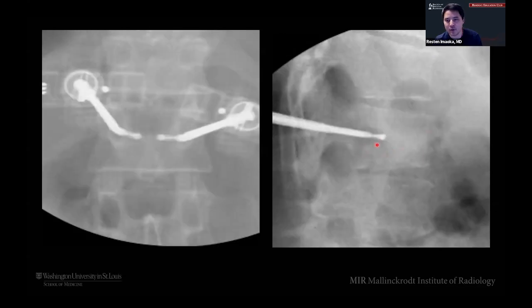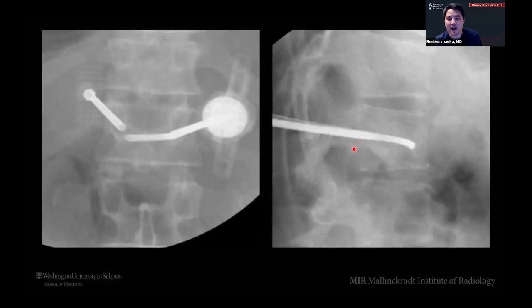Then I didn't include in here, but we would also pull them back if there's disease going into the pedicle, right? You can keep them straight, pull it back to the pedicle, and burn into the pedicle as well. And then after that, you're going to treat it like you would any other normal kyphoplasty, right? So here you've got your osteotome coming across midline. Here you're creating a channel for your balloon to follow, right?